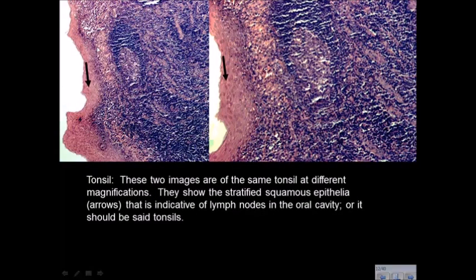And then we look at it under high power, and lo and behold, this is the same slide as the previous. Lo and behold, it's not a capsule, it's non-keratinized stratified squamous epithelium, so you're a tonsil.